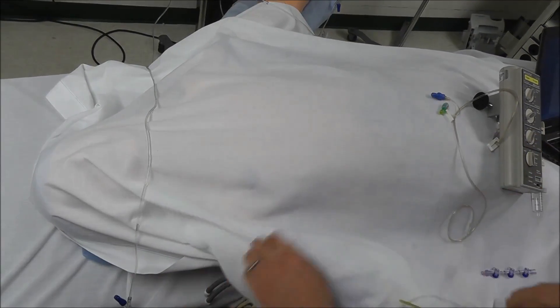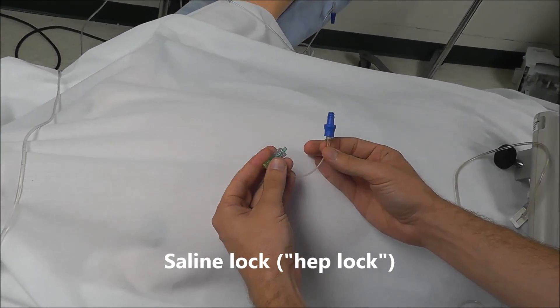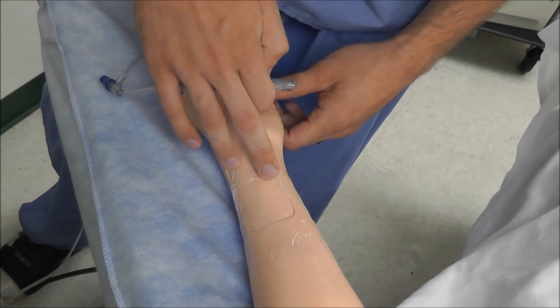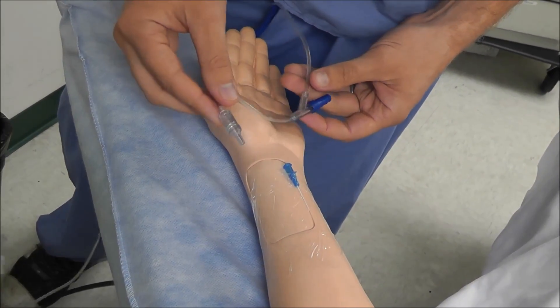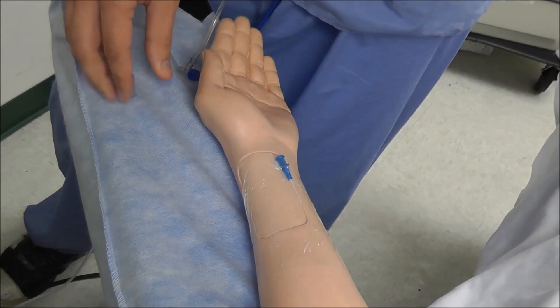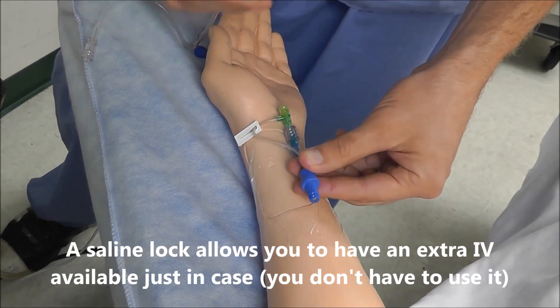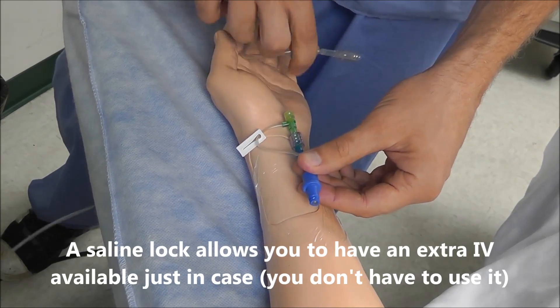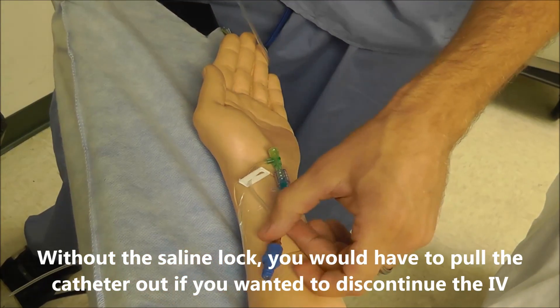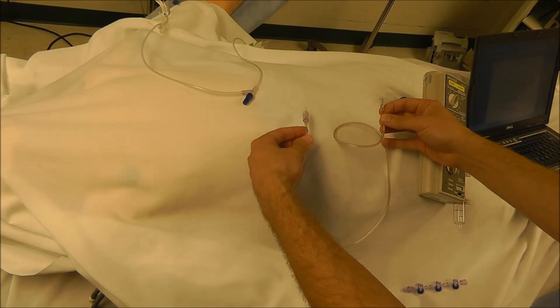The next type of extension is called a saline lock, which allows you to disconnect an IV and have it available for later use. When you get an IV started without a saline lock, you hook the IV tubing directly up to the angiocath. But with a saline lock, you hook the saline lock up to the angiocath first, and that lets you attach IV tubing at a later time. A saline lock also allows you to clamp off the port, disconnect the IV, and still have that IV available for later use.